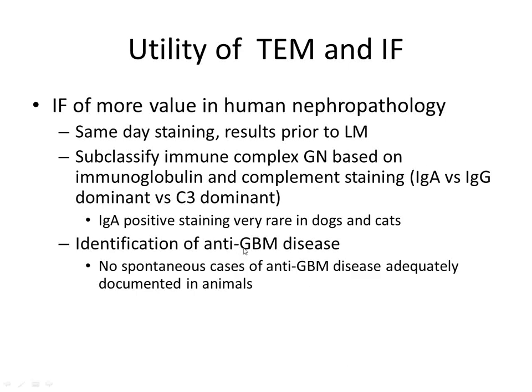And then also in human medicine, they have anti-GBM disease, and so if you guys think back to your second year pathology class where people talked about lumpy, bumpy immunofluorescence versus linear immunofluorescence, linear immunofluorescence is the antibodies actually targeting the glomerular basement membrane itself, and this is anti-GBM disease in humans.